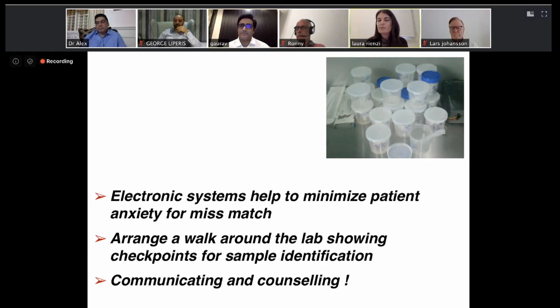It helps. Yeah, it's a big center, but it helps also small centers. It is a mistake to imagine that only big centers need it, because big centers are trained to work in shifts and always have a witness available. Big centers mean a lot of staff, which means that you are never alone in the lab and you have highly trained colleagues, while in small centers you may have one embryologist trained, one in training, and one technician, and you may be alone on Sunday, you may be alone on a holiday. So absolutely, it is not related to the amount of cycles that you do, probably it's related to the number of staff per cycle.